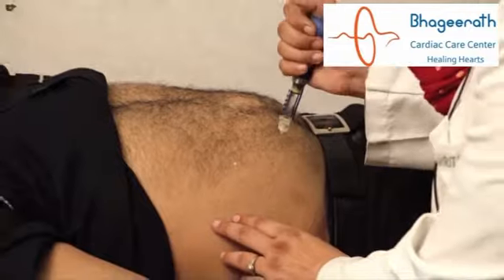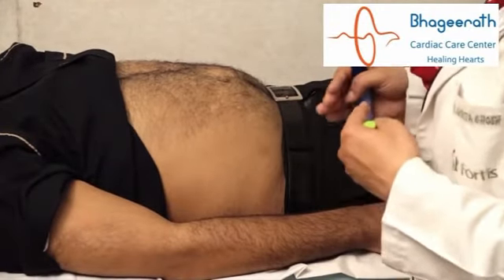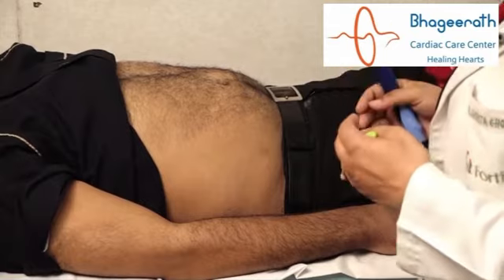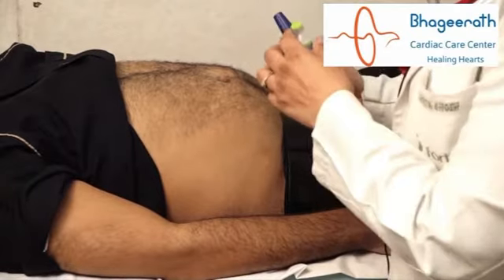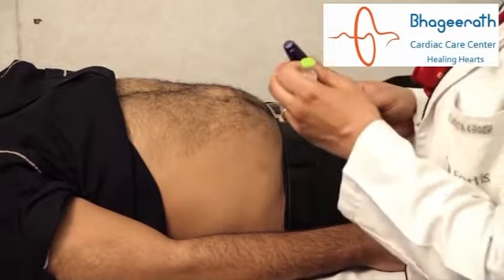Many of your patients are on premixed insulin or NPH or a different combination. So whenever the patient is on a premixed insulin or an NPH insulin, make sure you tell your patient to properly mix the insulin. Whether the patient is using a vial with a syringe or a pen, the mixing has to happen properly.